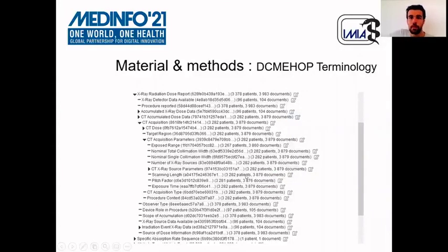This is even more important when we integrate structured reports. When we open the X-ray radiation dose report node in this terminology, we have the same complex organization as in the original structured report. So this terminology and the way we are building it make us able to search for DICOM imaging exams or structured reports with a specific value, or for any metadata anywhere in the report or in the DICOM document.